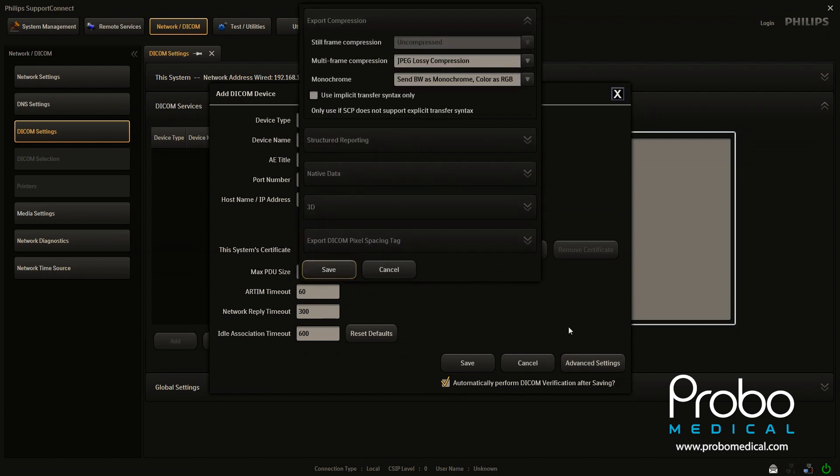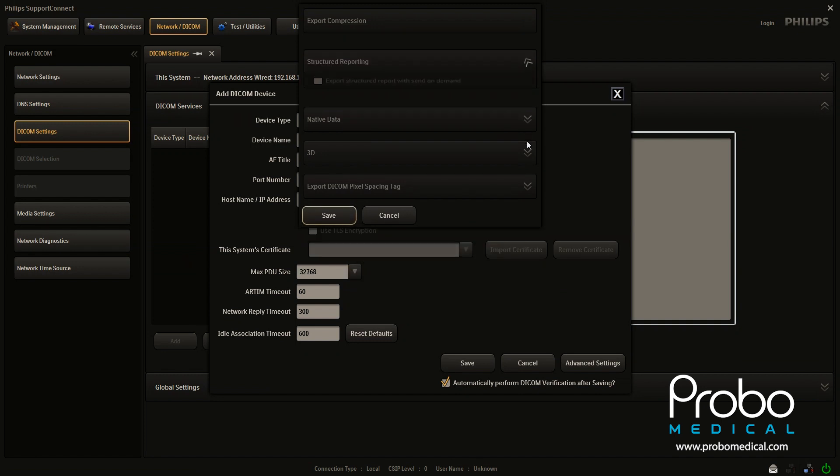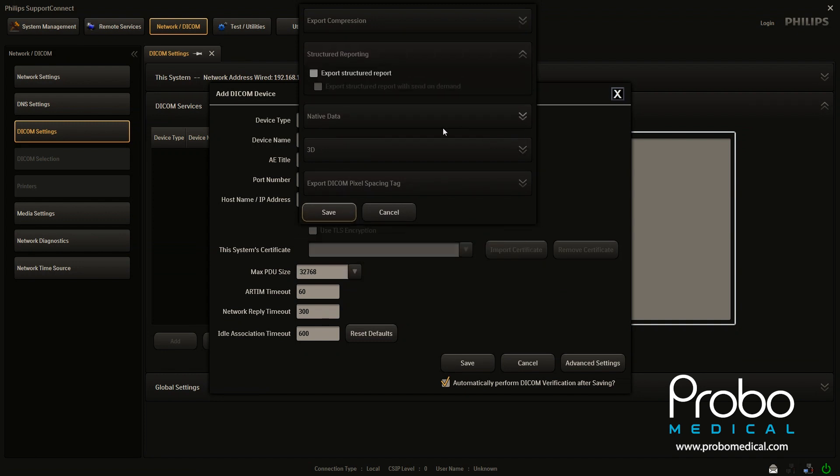And one thing we want to do is come over here to structured reporting. And if you're going to use structured reporting, you want to click export structured reporting. And then there's another box here. It says export structured reporting with send on demand.